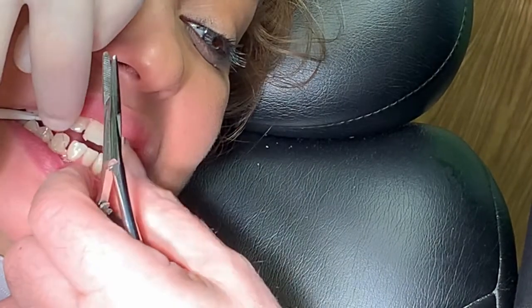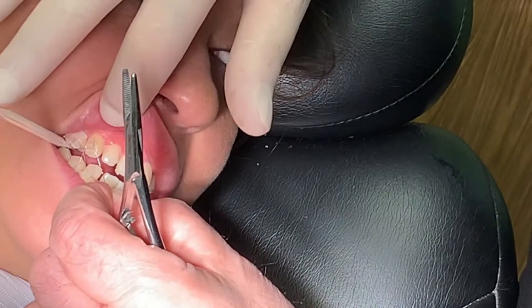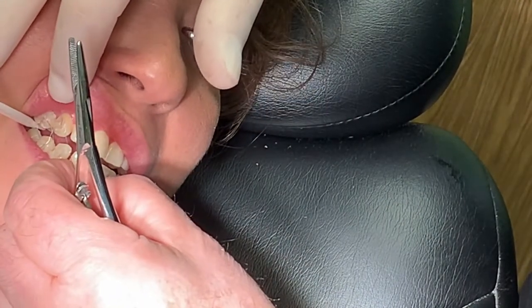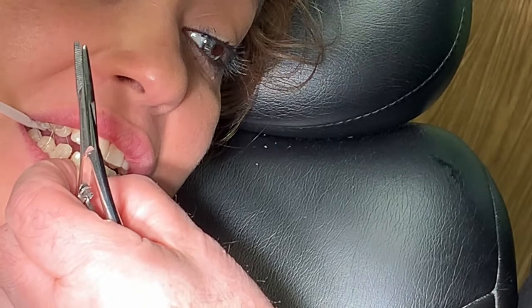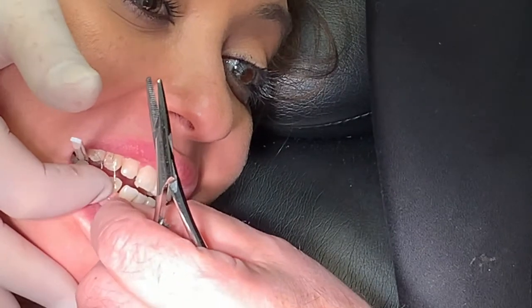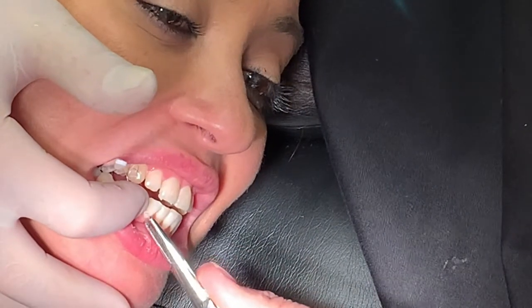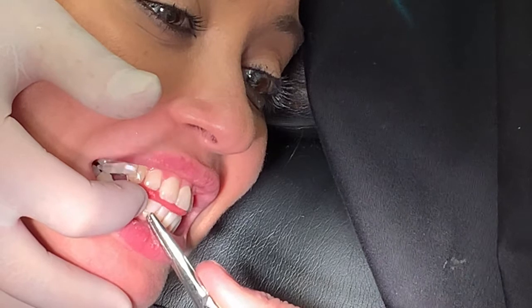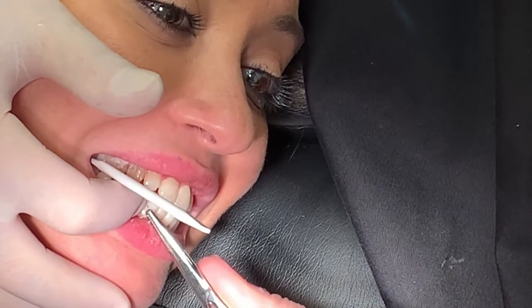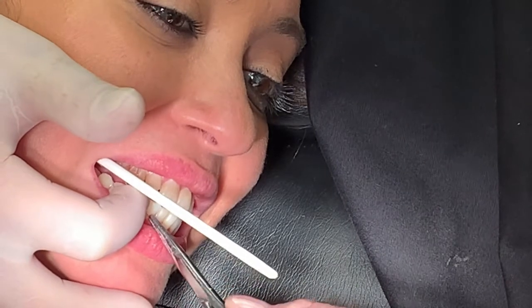Okay? Now, you look to see, do you have too much wire? Have you made it too tight or too loose? It looks to me that it could be tighter. So I'm going to come back, I'm going to hold the front and make some more tail. Make some tail and take up the slack.